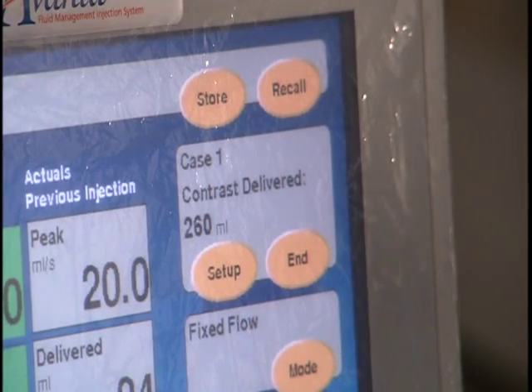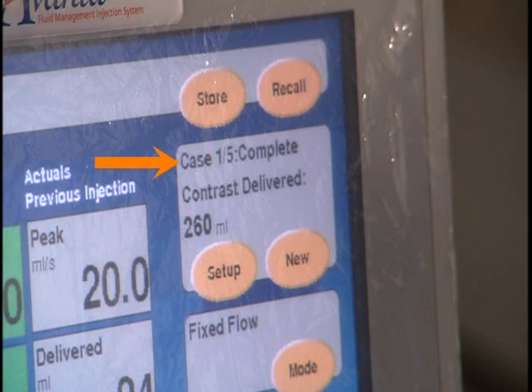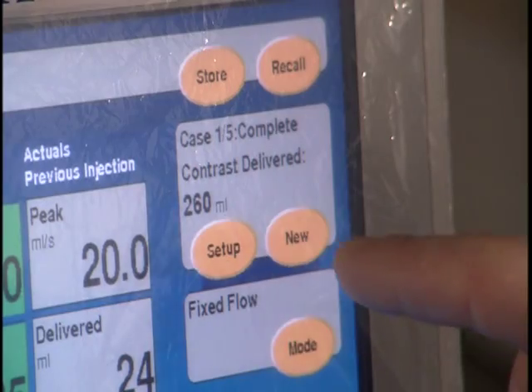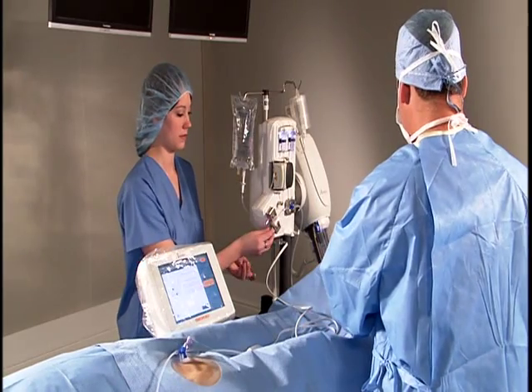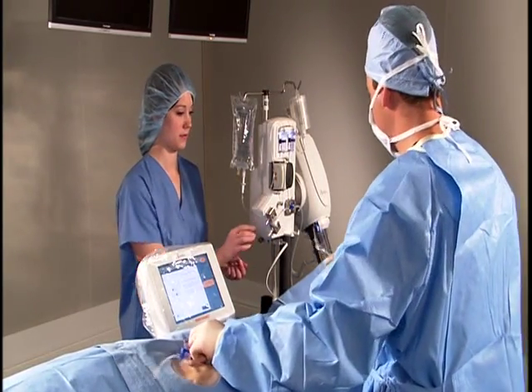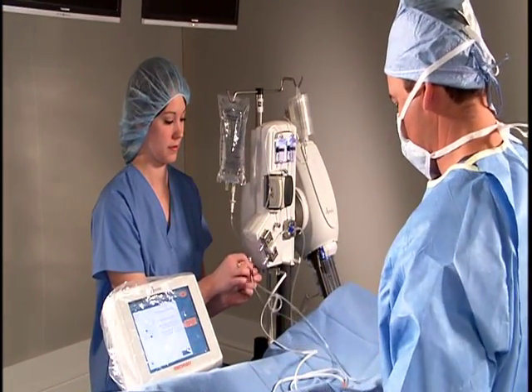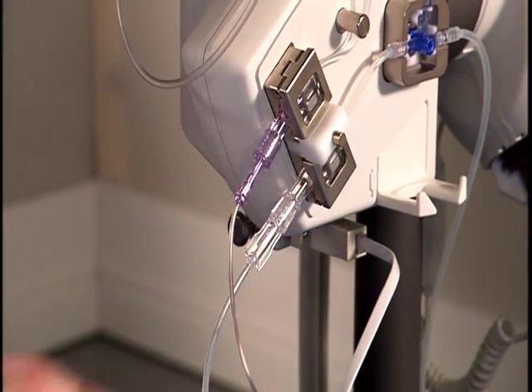Once the S-PAT is removed, touch End. Verify the number of cases you have performed. If you have not yet completed 5 cases, you can start a new case by touching New. To start a new procedure, attach a new single-patient disposable set. To view the S-PAT setup, return to Install Single-Patient Disposable Set. The S-PAT must be exchanged for each patient.